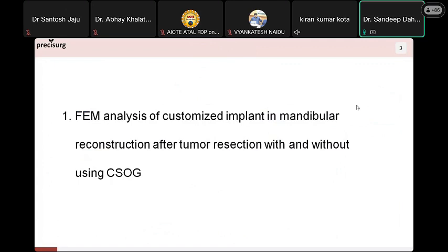Also, as compared to the Kirschner wire, these custom implants are giving a proper mechanism to this particular finger. Because of the small and compact size, the fixation area is less. Surgery is performed through a single and small incision. That is the advantage of this small implant.